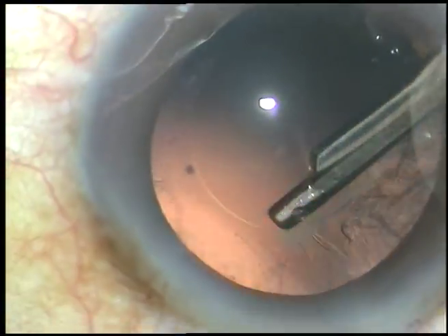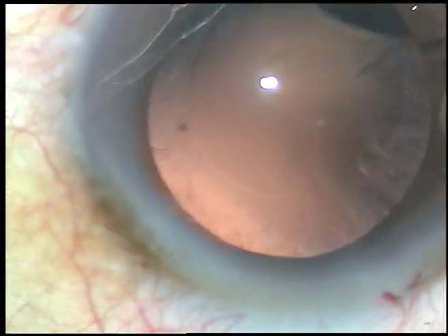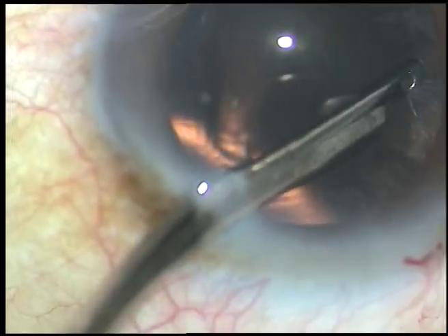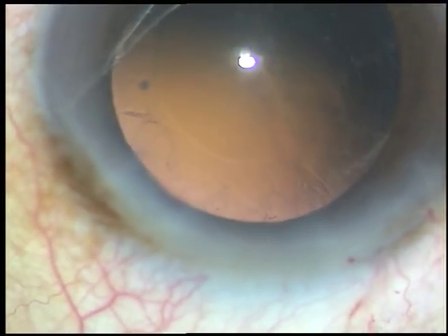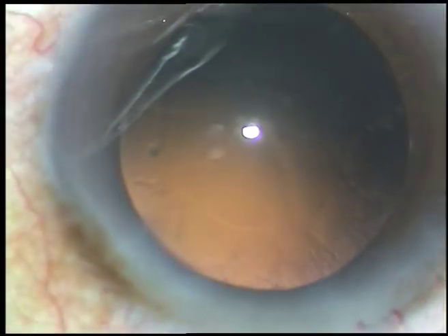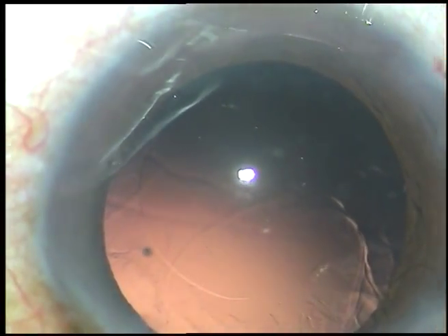The side ports are about at the 3 o'clock position — that is, 90 degrees away from the main incision. So, the astigmatism being induced by the main incision is neutralized to a great extent. Almost, the astigmatism induced will be zero, because astigmatism induced by the main incision will be neutralized by the side ports.